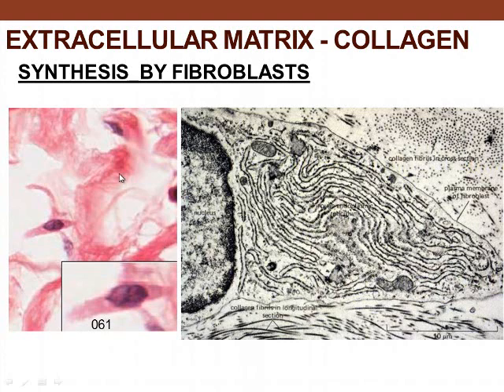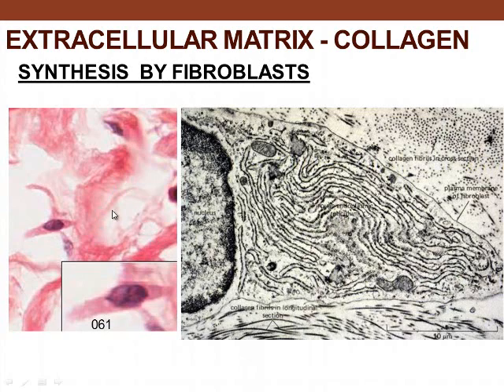Here we see a cluster of collagen bundles and the fibroblasts that create them. Looking at the spleen, we have a capsule of dense irregular connective tissue surrounding it, with lymphoid nodules inside.